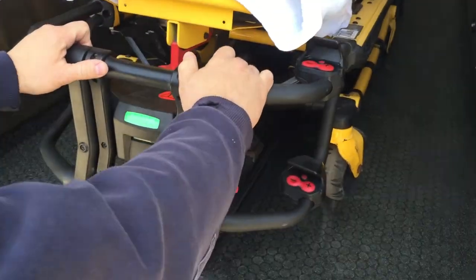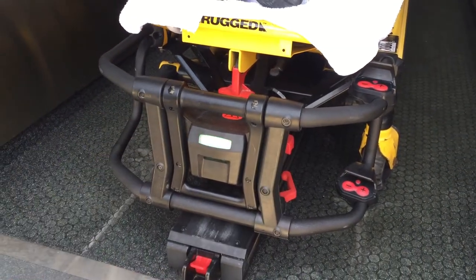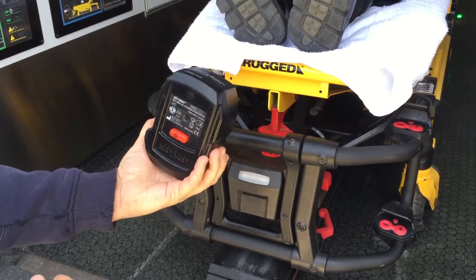We also got the new SMRT batteries which are featured on this system right now. What those do is they charge while the cot is in the holster. It makes it a lot easier because now we don't need to run across a situation where we can run out of battery.